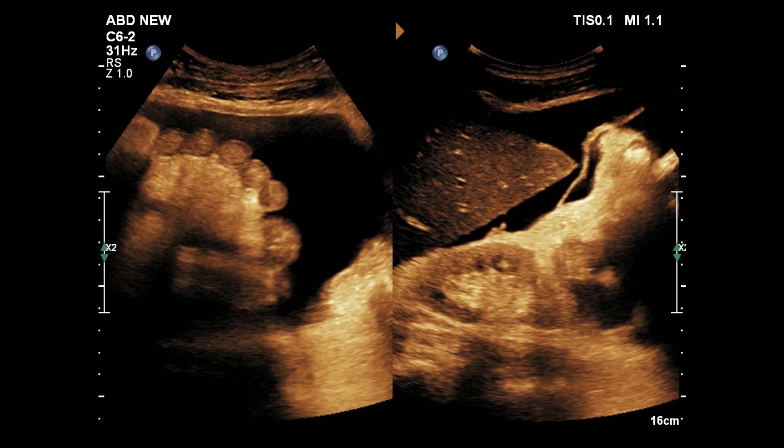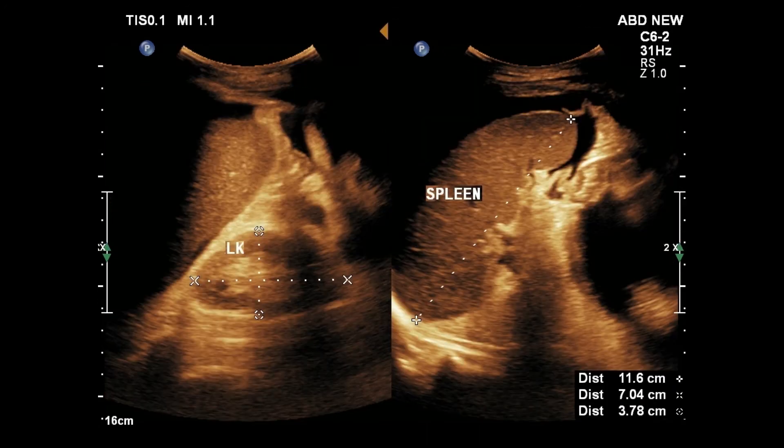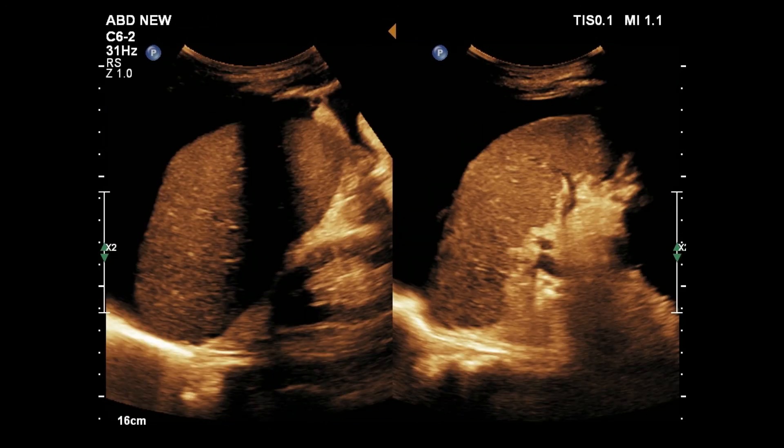On the left picture, intestinal floating loops are seen. Iliac regions show bowel loops floating on fluid. Spleen is prominent and the left kidney is small and echogenic. Fluid is seen at the splenorenal angle also.